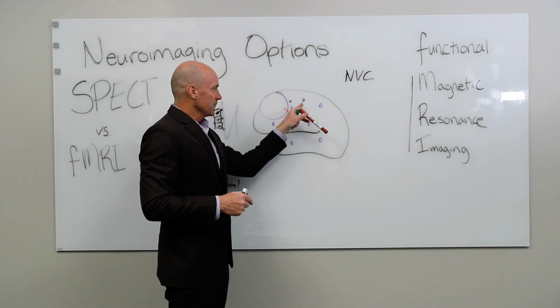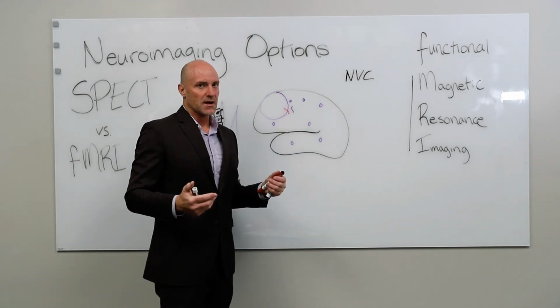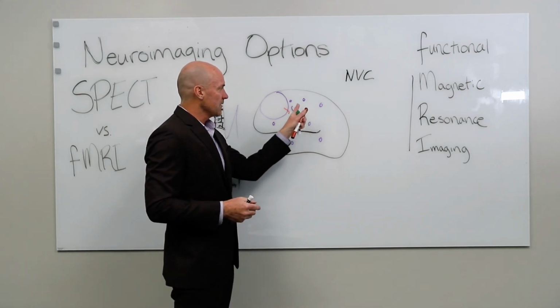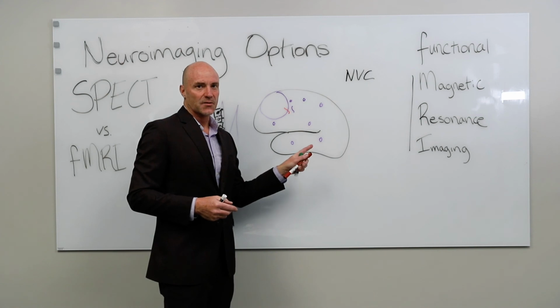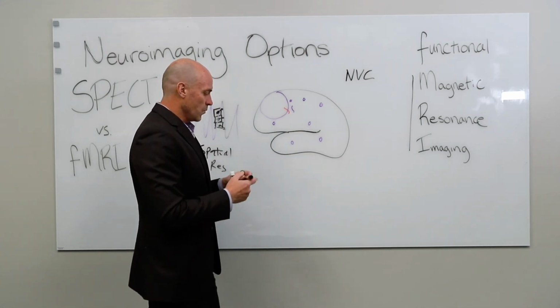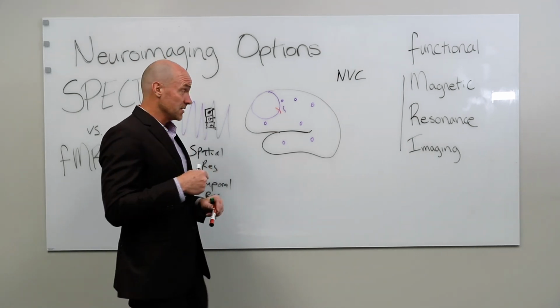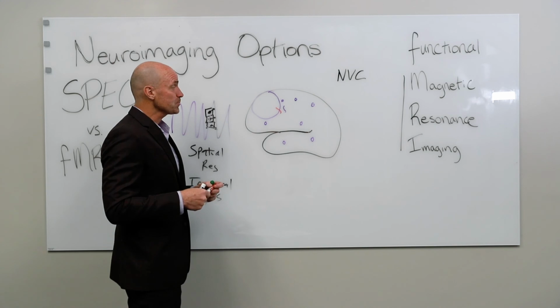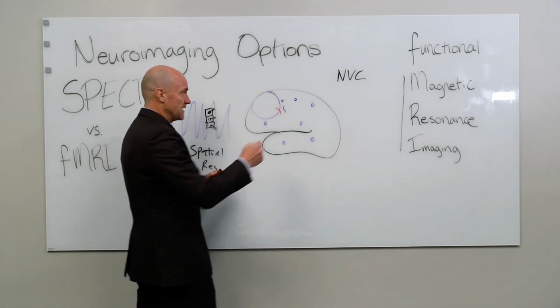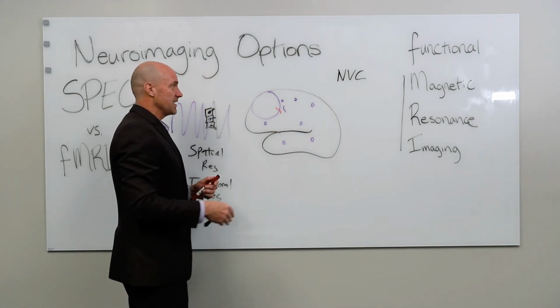You might have parts of the brain that are working mostly well, but there seems to be something that goes wrong in getting that really fine-tuned blood flow to those regions. And so this technique, fMRI, becomes useful in concussion assessment, because we can look at where neurovascular coupling is deficient across the course of a task.